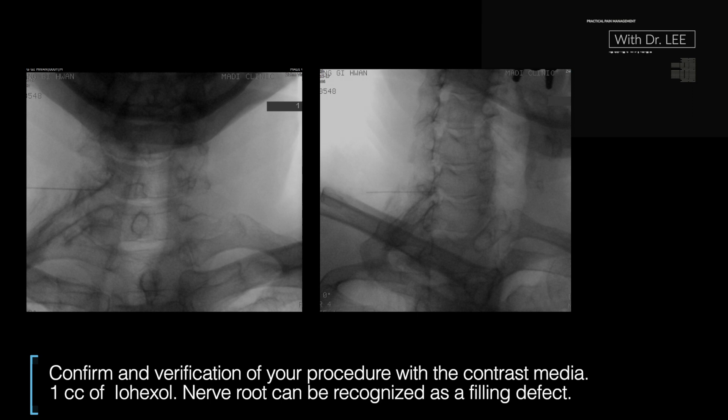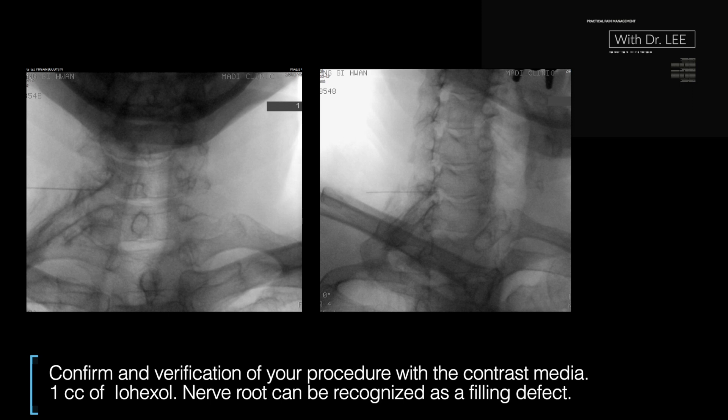I need to confirm and verify my procedure with the contrast media. I use 1 ml of iohexol. Of the two targets, I infiltrate contrast media at only one level. This is C7. The root can be recognized as a filling defect. Thank you for your attention.